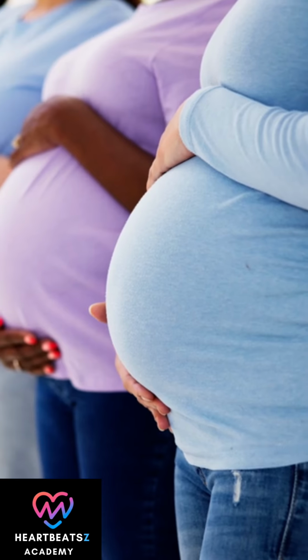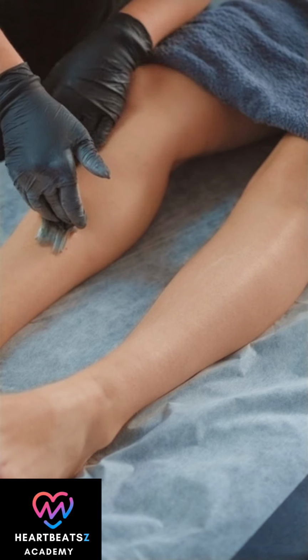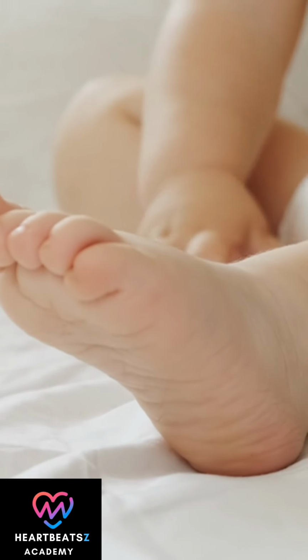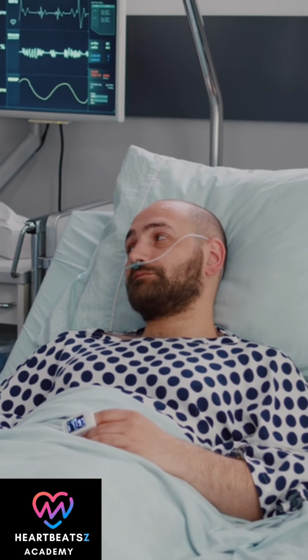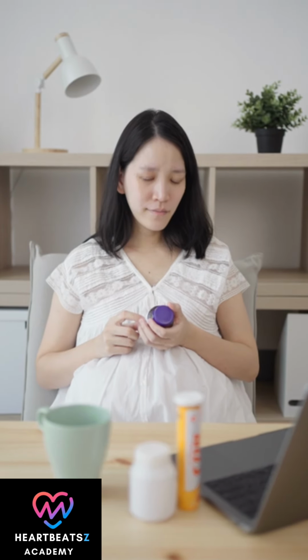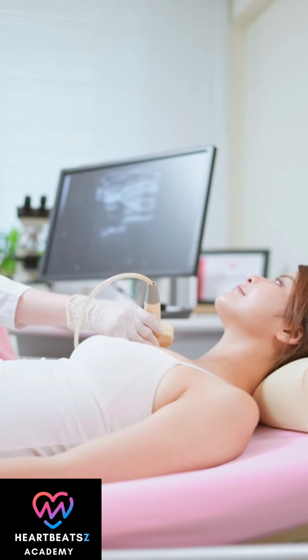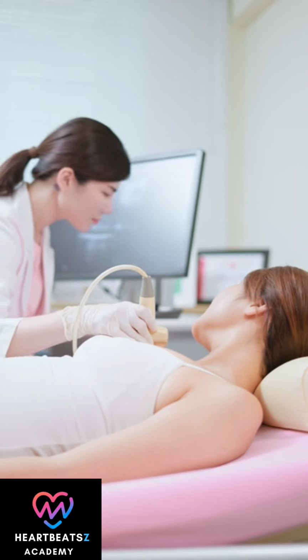Abdominal and pelvic imaging. Ultrasound is a primary imaging modality for many abdominal and pelvic conditions. Gallbladder and biliary system. Diagnosing gallstones, cholecystitis, gallbladder inflammation, and evaluating bile duct obstruction. Liver. Assessing for fatty liver disease, cirrhosis, tumors, benign and malignant, cysts, and abscesses. Kidneys and bladder. Detecting kidney stones, hydronephrosis, swelling of the kidney due to urine backup, cysts, tumors, and evaluating bladder function and masses. Pancreas. While often challenging due to overlying bowel gas, ultrasound can sometimes visualize pancreatic masses or inflammation.